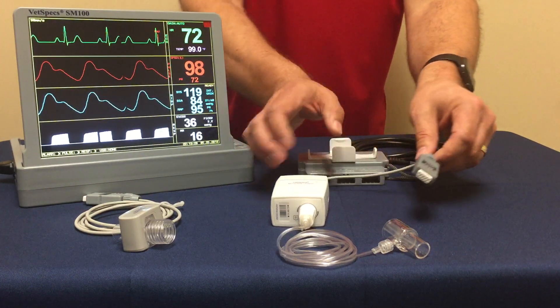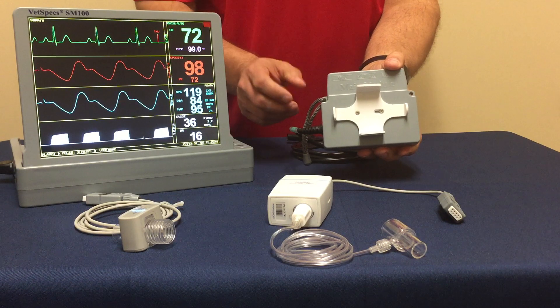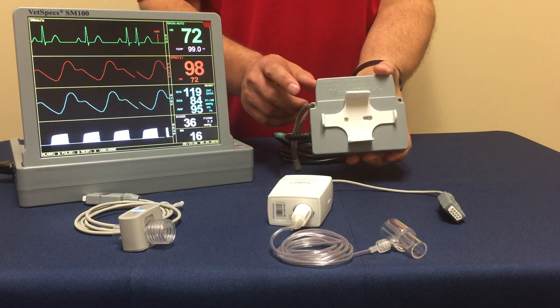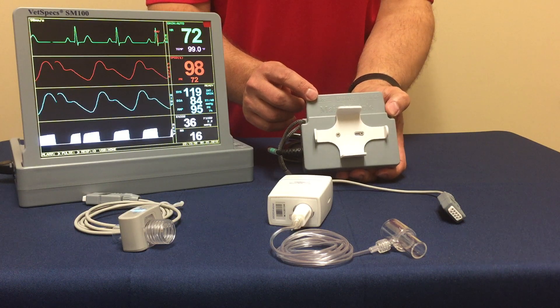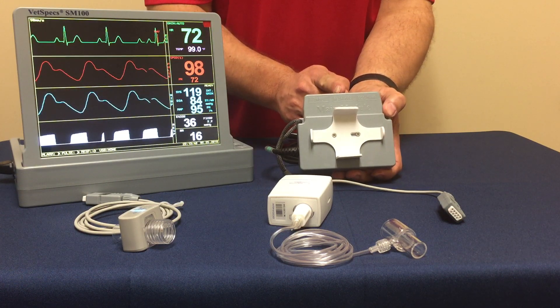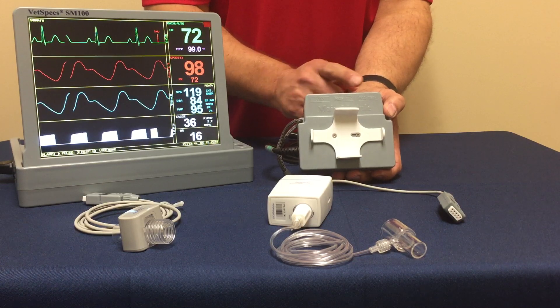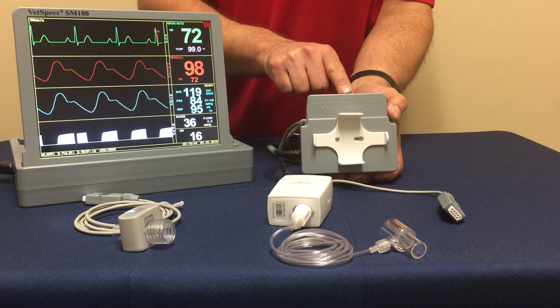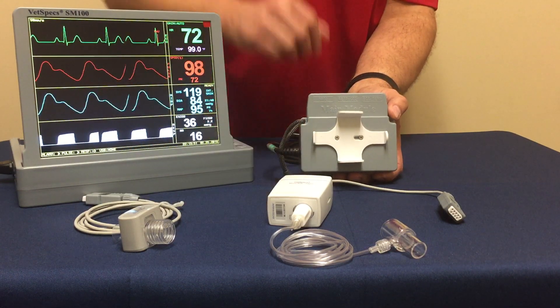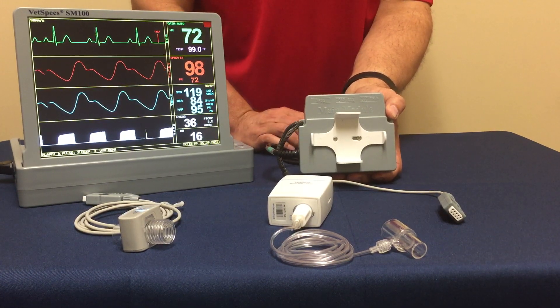This is able to connect right to the multi-parameter module that comes with the SM100 model. The module has three ports: one for your SpO2, one for your respiration and CO2, and then also one for your ECG and temperature. For the capnography function, we're going to be focusing on this middle port. Either of these two modules or sensors are able to connect directly to that port.